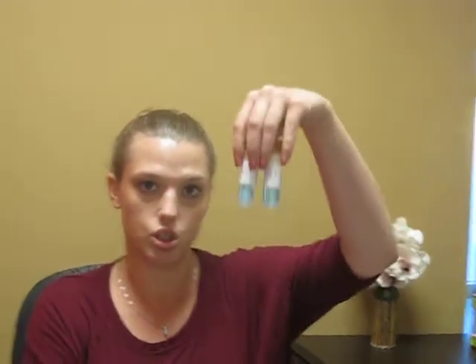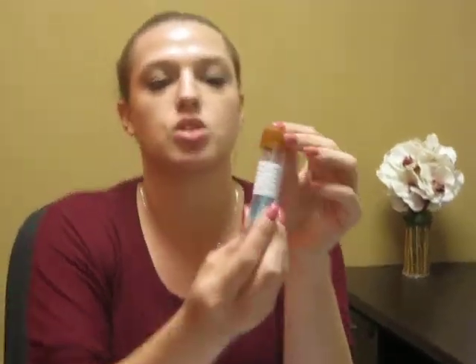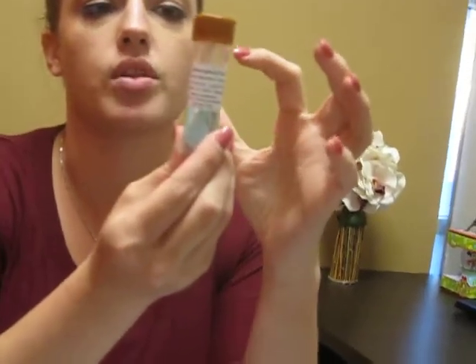I do want to let you know that when you read the stool sample instructions, it is going to tell you to do the B vials first, which are these 2 blue ones, wait 2 days later, and then do the A vial, which is this pink vial. You do not have to do that. You could do all of them in one stool sample. Just make sure you get them from 3 completely different areas. And watch out for this pink notice, because some of our boxes were labeled wrong, so they put the sticker lower than it's supposed to be.